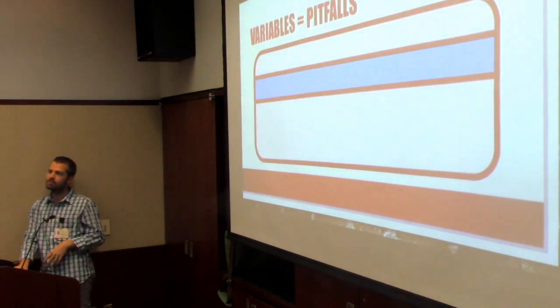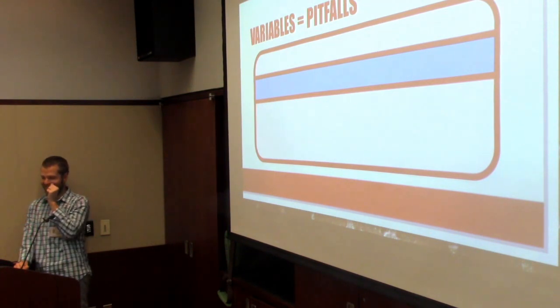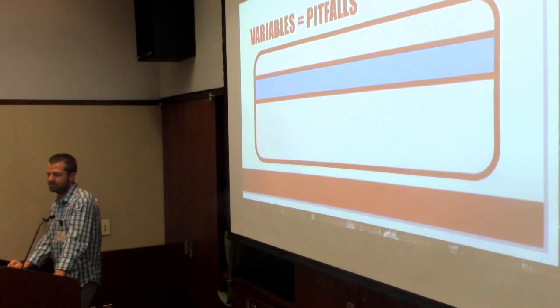There's a quick and dirty way to remember, as far as short axis versus long axis, where you put the selection marker: 96. 9 o'clock for short axis. So relative to you, if you put the selection marker at 9 o'clock, if you move your needle this way, it'll look that way on the screen. And if you put your selection marker at 6 o'clock relative to you, as you go right down the middle of the probe, you'll see that needle go in the same direction on the screen. So just remember, 96. Your scores, 96 and above, right? No, just teasing. 96 is confusing. You get everything set up, and then you put the selection marker at 12 o'clock, and you're expecting it to come from this direction, and it comes from the other direction on the screen. So that's critically important.